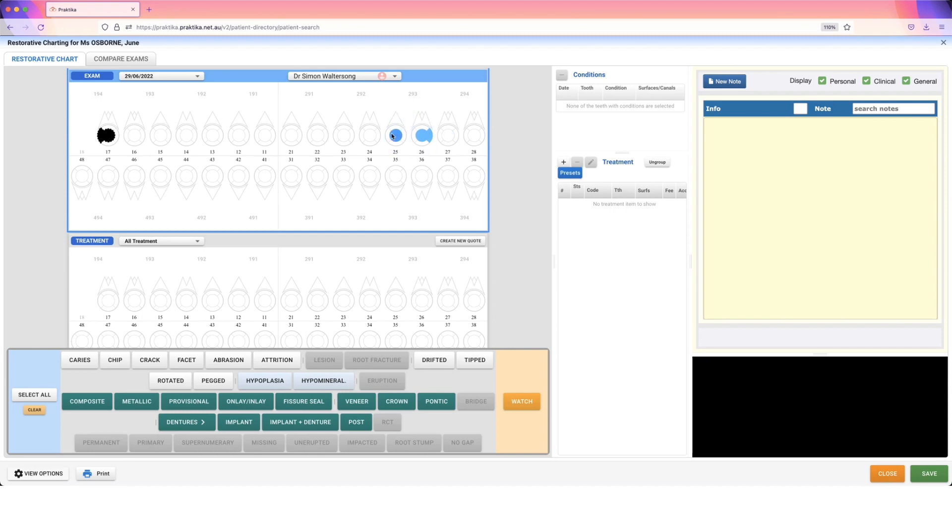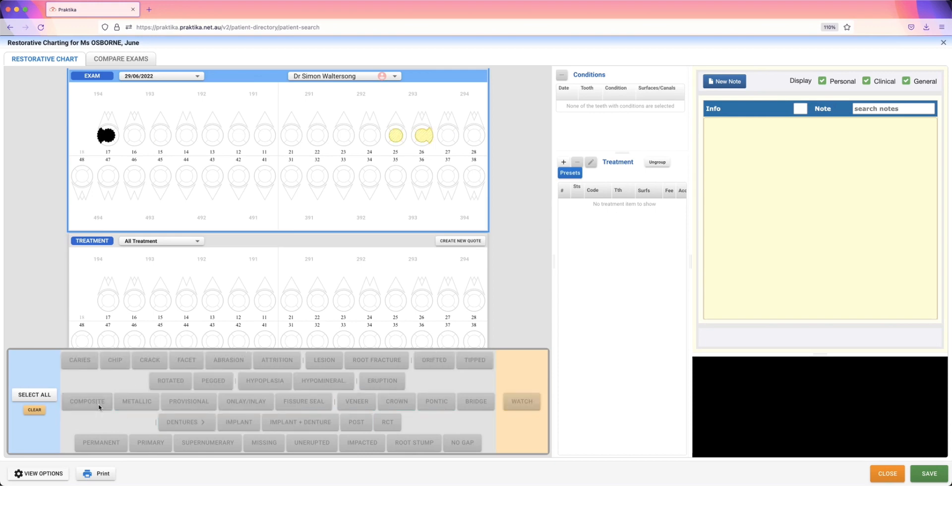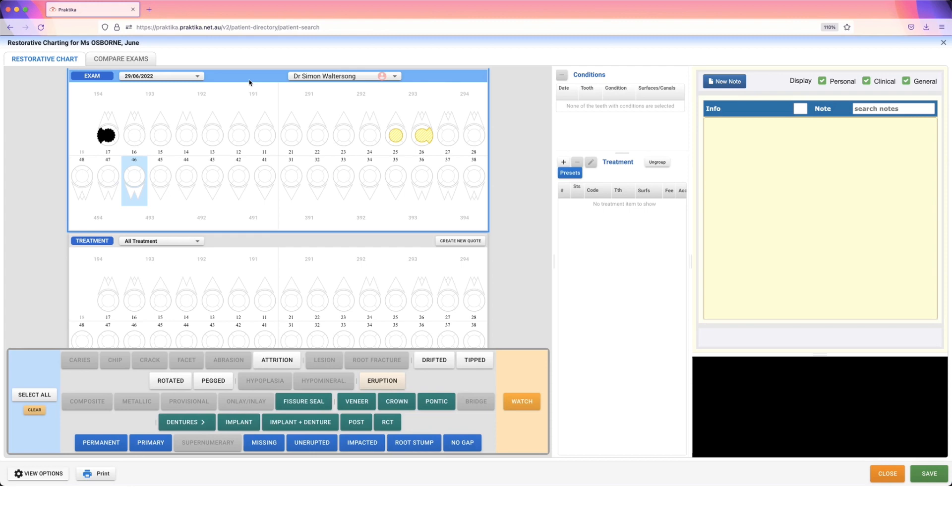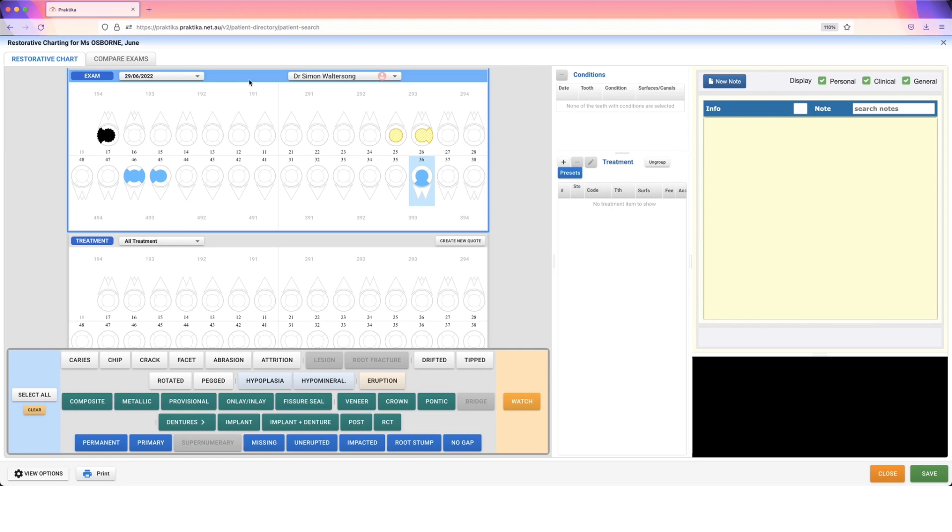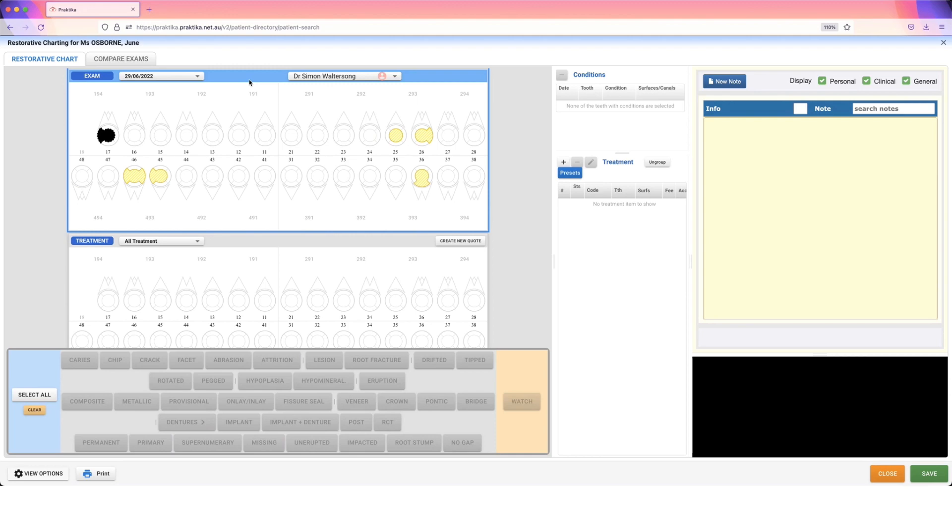Maybe they've got existing composites. You are also able to use your keyboard instead of selecting it with your mouse. So I put my mouse down completely and on my keyboard now I'm going to say 4-6. I just type in the numbers D-O-M and I type in the letters. I can keep going through 4-5 D-O, jump across to 3-6 B-O. It will remember your previous selections until you're ready to put in a condition. From here I can also use my keyboard to pop in some shortcuts. So if I say shift and C, it's going to pop in those composite fillings for me.